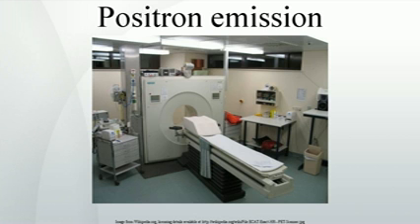volume together. 3D. 3D techniques have better sensitivity, because more coincidences are detected and used, and therefore less noise, but are more sensitive to the effects of scatter and random coincidences, as well as requiring correspondingly greater computer resources. The advent of sub-nanosecond timing resolution detectors affords better random coincidence rejection, thus favoring 3D image reconstruction.